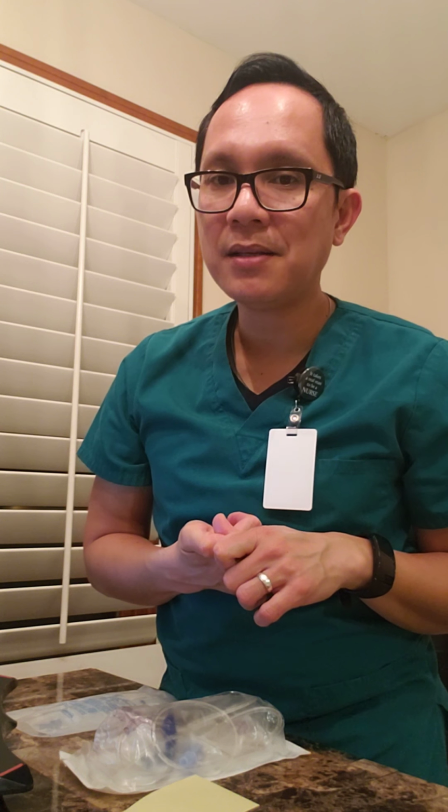I'm going to be assessing my patient before I give the medication. The right education. Of course, I'm going to be educating my patients as to the medication that she is going to be getting. And then the right evaluation. I'm going to be evaluating my patient before and after I give her medication.